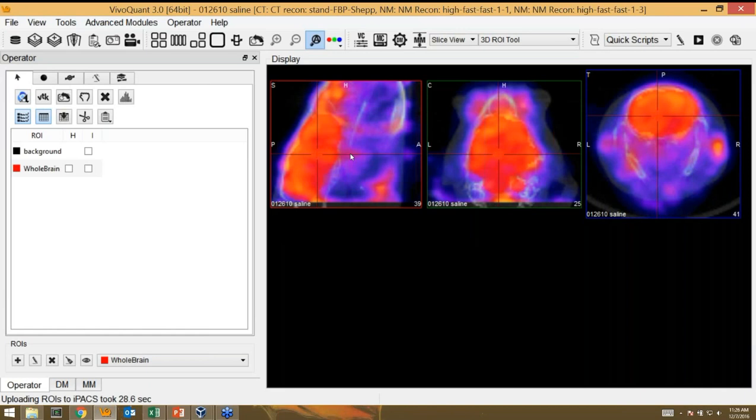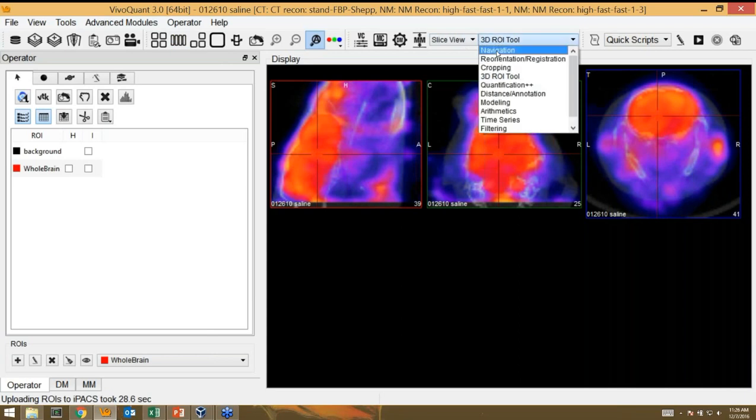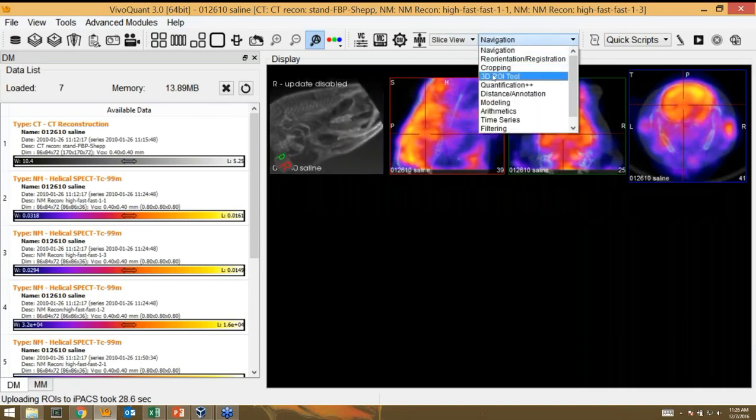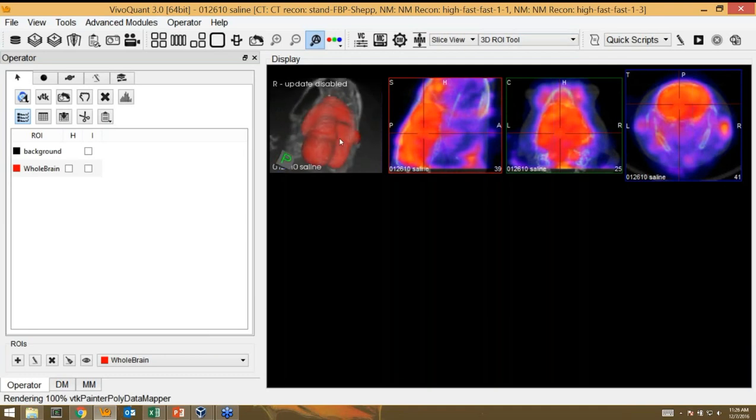Okay, so that's more or less your standard workflow. Of course, we still have our general tools such as image saving, making a MIP, saving a movie, things like that. These things really haven't changed. Of course, we can always pull up a MIP just because they're fun to look at, maybe without the ROI or with it. Again, that's a pretty lumpy ROI, as I did just draw it pretty quickly, but just to give you that visual effect. So as I mentioned, those things really haven't changed.